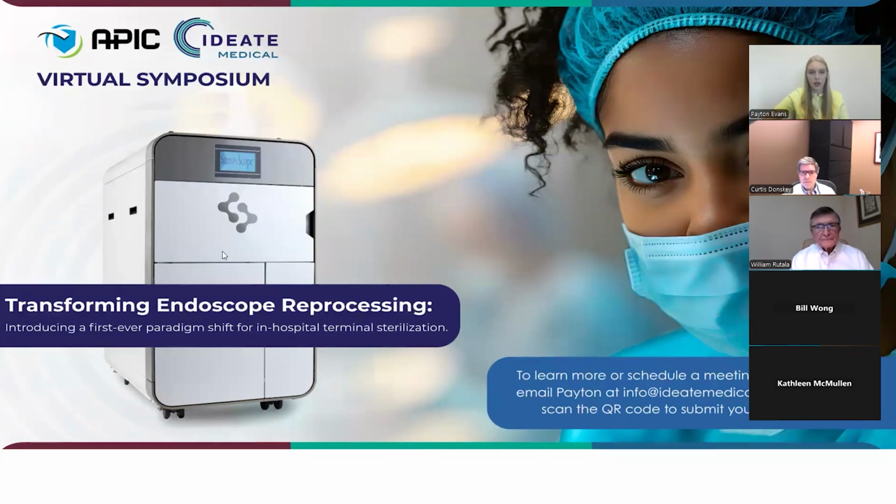This is a great question. Were any of the processed endoscopes looked at with a borescope to see if there was any internal damage from sterilization? Not in our study. No, I don't think we actually used a borescope for any of that. We did have scopes go back for evaluation after a lot of our testing, but there were no issues within the actual lumen channels themselves.